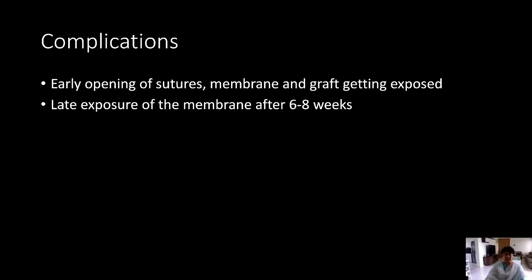So let that be an implant, let that be a graft, let that be a membrane. Anything that is foreign which is going inside the body, if it is not stabilized, I feel that it doesn't work, because then it has all the chances of floating wherever it wants to float, and there's going to be some bleeding after the surgery, some edema, some fluid there. So stabilization of the membrane is needed, as far as I believe in that procedure, and I always pack all the membranes, as you have seen in all the cases so far.